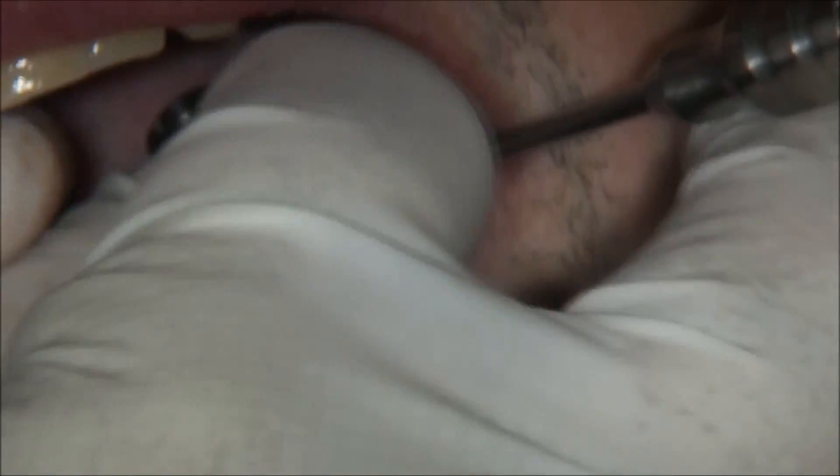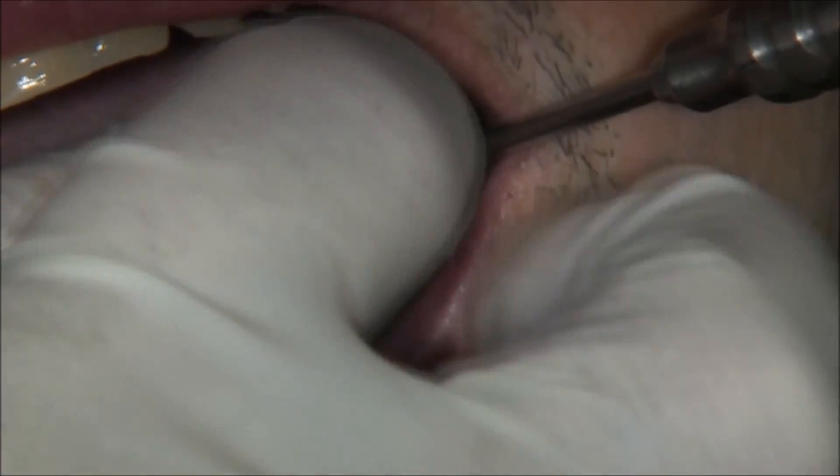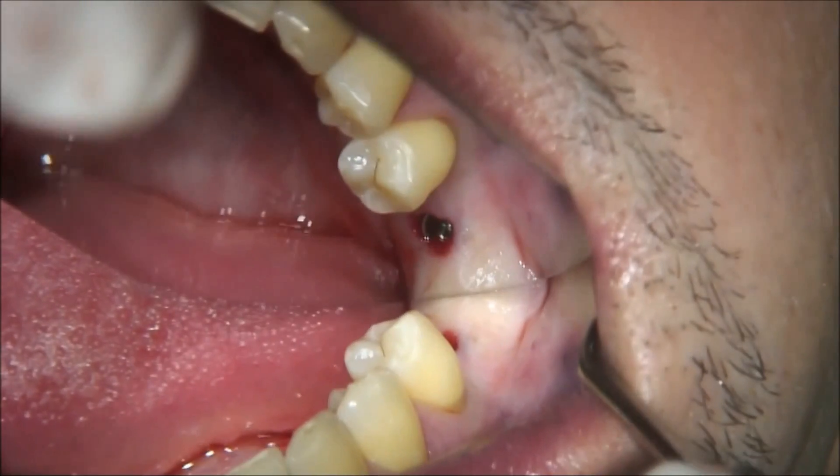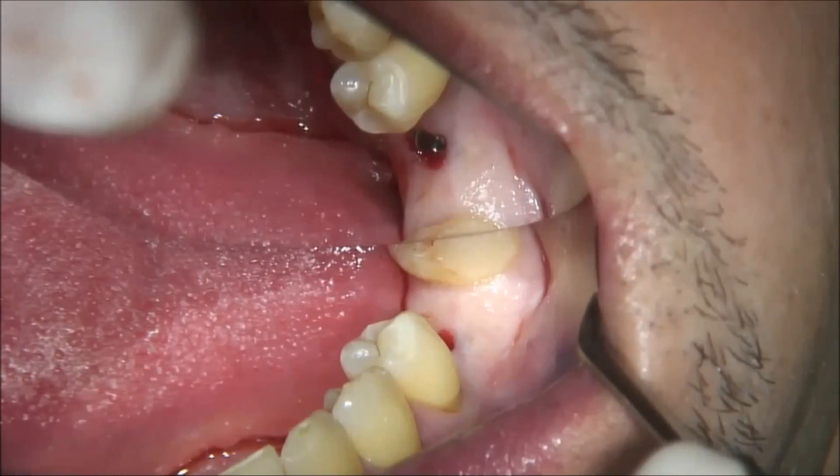The cover screw is screwed with finger pressure. Now I show you the perfect implant position with a cover screw — this is an implant in the first molar region.